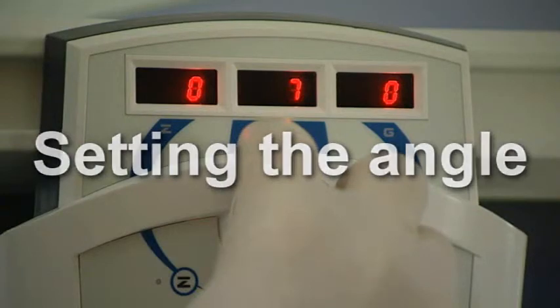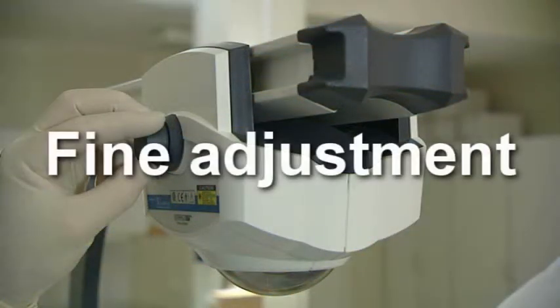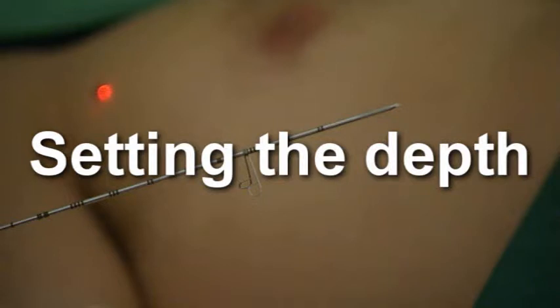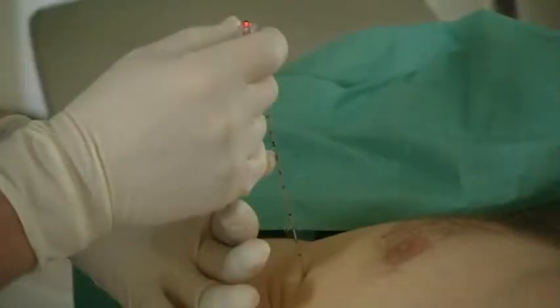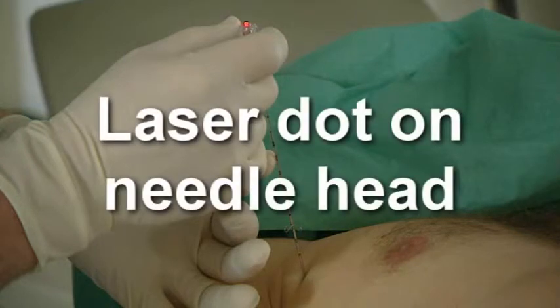Dial in the appropriate puncture angle before positioning the laser dot onto the chosen entry point by using the fine adjustment wheel. Mark the puncture depth on the introducer needle and place the needle tip exactly on the entry point. Raise the needle until the laser dot illuminates the needle hub, at which time the needle is aligned.